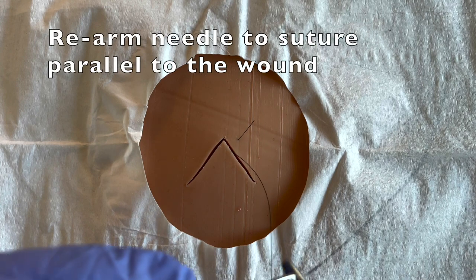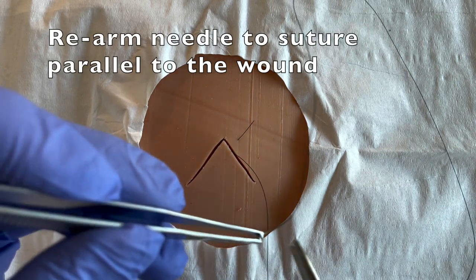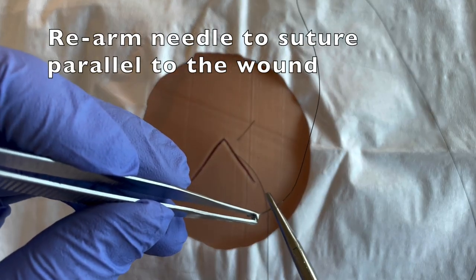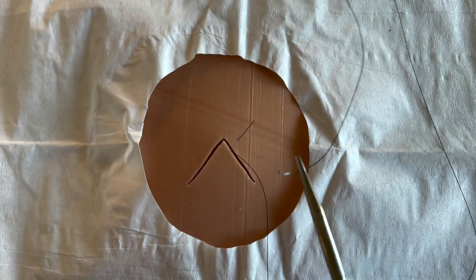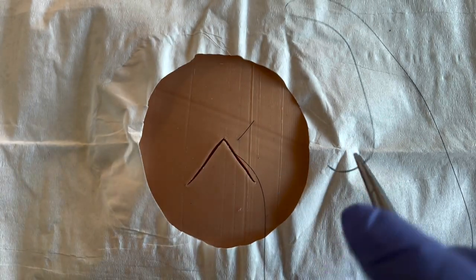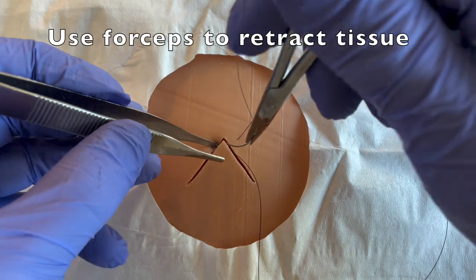Next, you're going to rearm your suture needle in a fashion that will allow you to suture parallel to the wound as opposed to perpendicular to the wound, because now you're going to go through the edge of that flap.